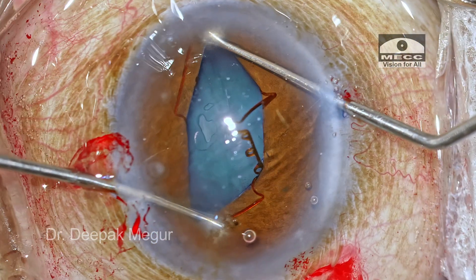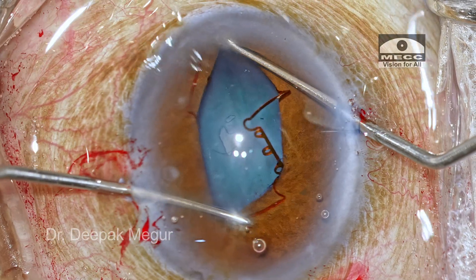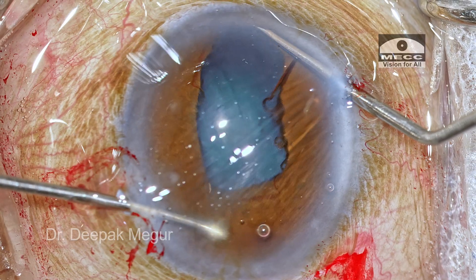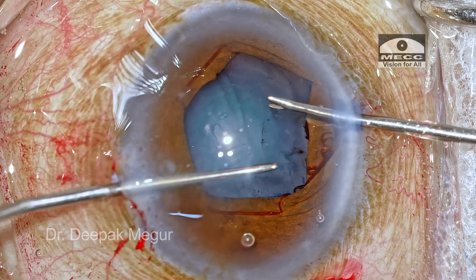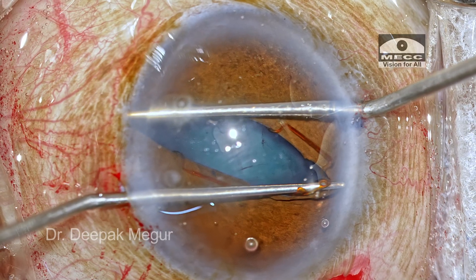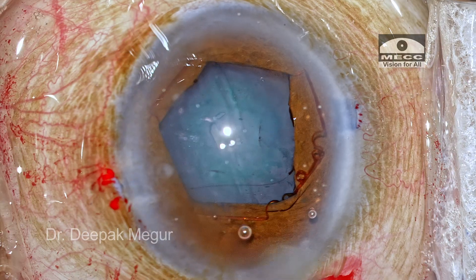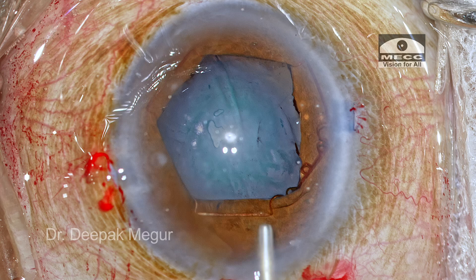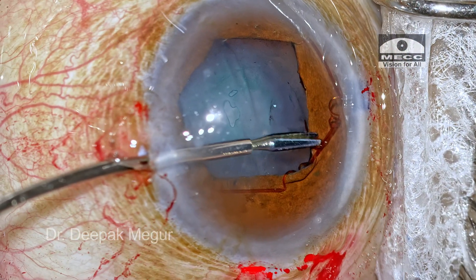There's no need to disengage the already-engaged notches. Just going in with two Y-hooks, I'm pulling in four directions. As I make the first pull I can feel the pupil sphincter tear — the pupil now becomes bigger. I make the same stretch maneuver 90 degrees away from the primary stretch. We've now created some sphincter tears which make the iris more malleable, so the remaining two notches of the BX device can be engaged successfully.